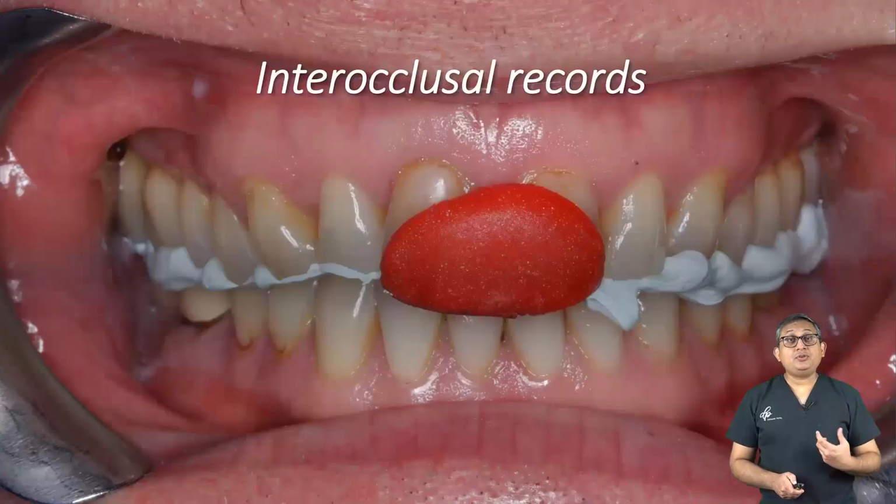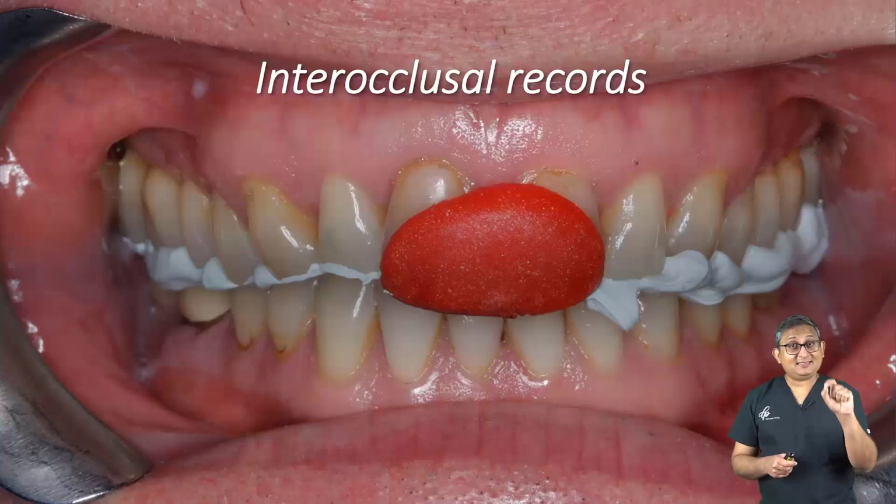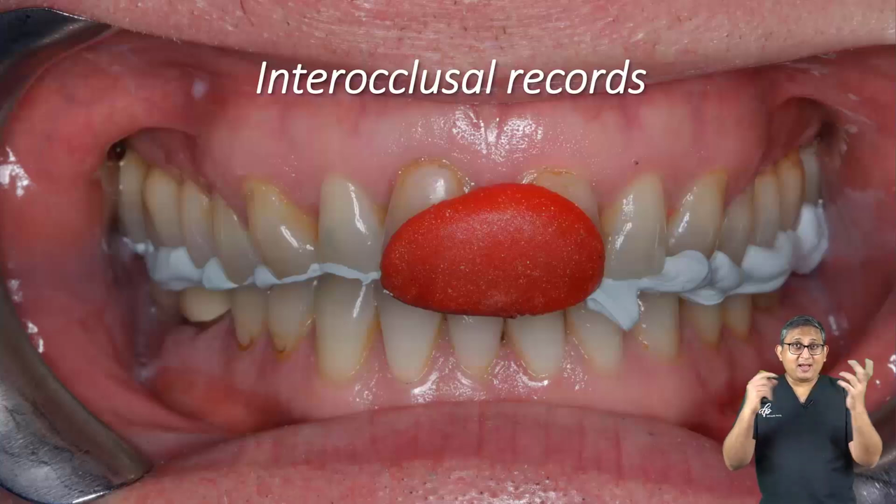Once that's done, you're going to record CR. And I always tell people, what's wrong with this slide? The reason there is something wrong with this slide is I've used bite registration material for my CR record. Now, this is not the right type of material for this type of OVD. You need to make sure that you have at least 2 millimeter space when you're using bite registration material, because it's so flimsy, even the hard ones, that when you take it out, it'll just flap about.